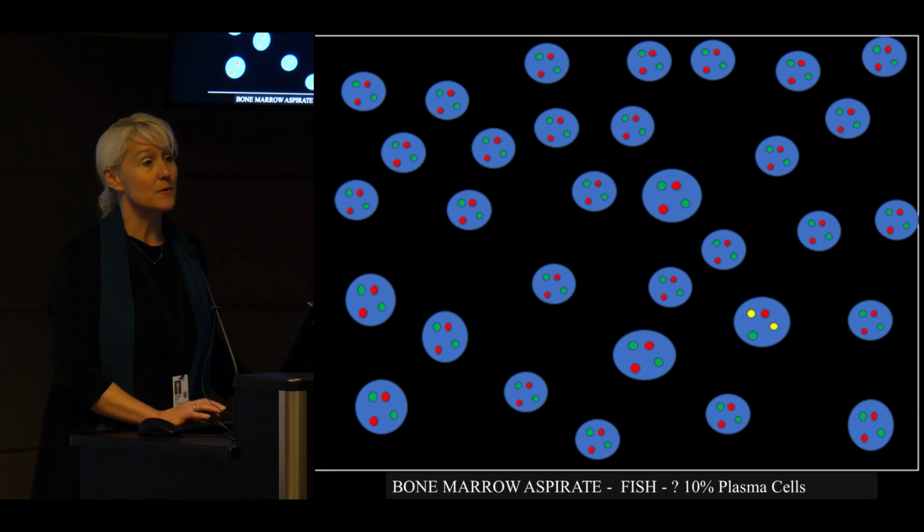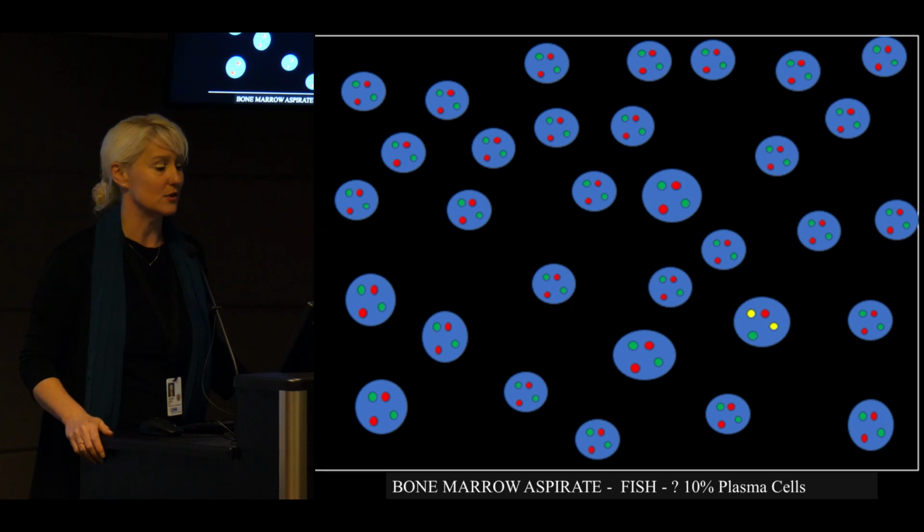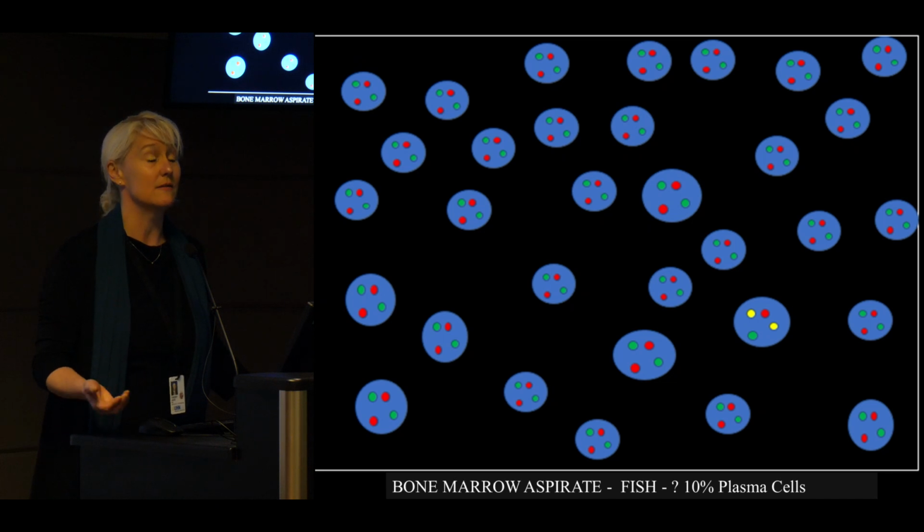Now, although 10% plasma cells has been confirmed by the hematopathologist, there are several pulls that are taken from a patient. So the case or the sample we receive, often it's labeled number 5 or 6, but we don't know if it's the first pull as recommended in guidelines.